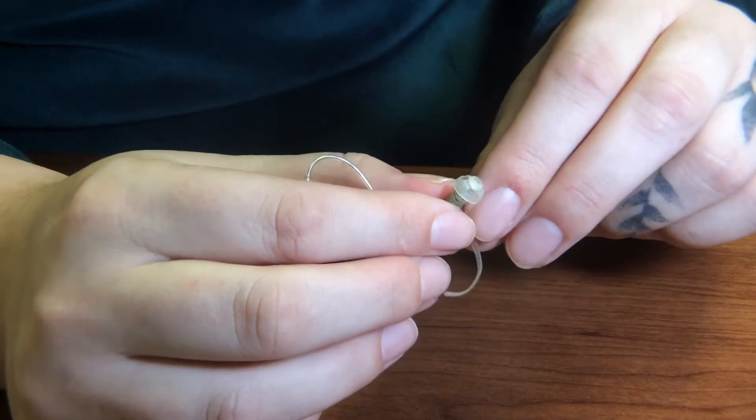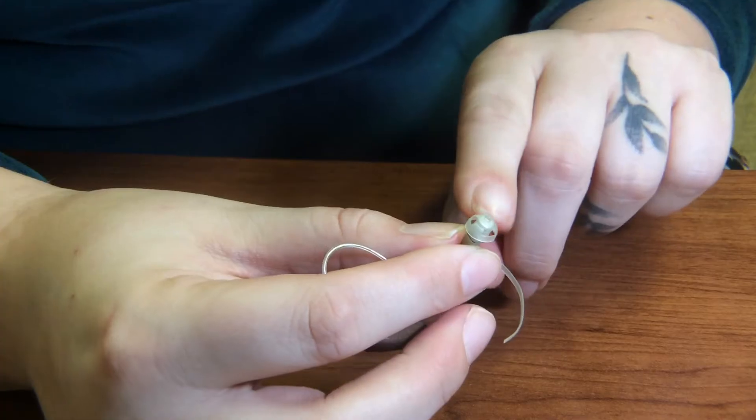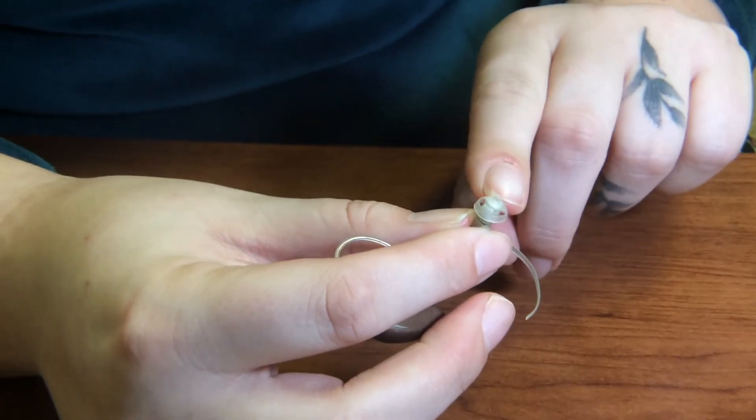To perform a visual check on this hearing aid, we need to take a look at the dome and make sure that there's no debris inside any of the openings.